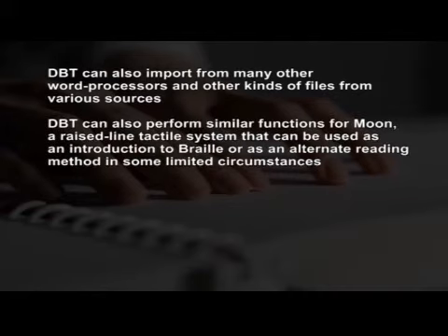DBT can also perform similar functions for Moon, a raised line tactile system that can be used as an introduction to Braille or as an alternate reading method in some limited circumstances.